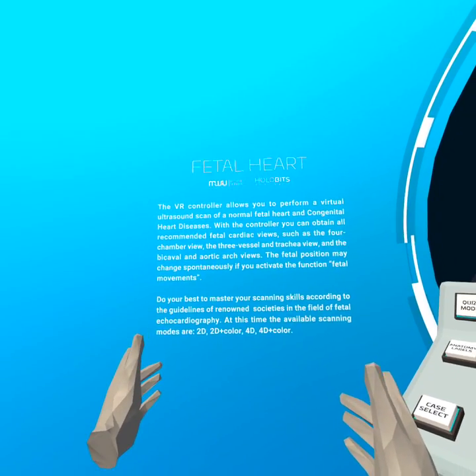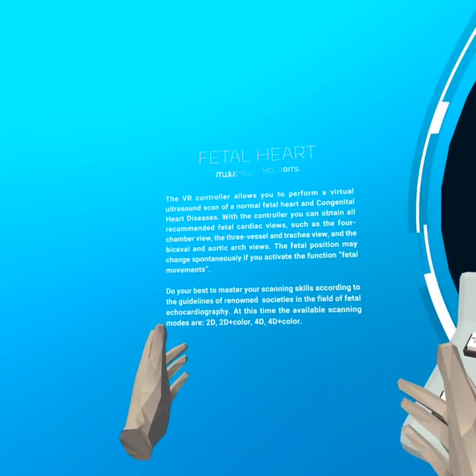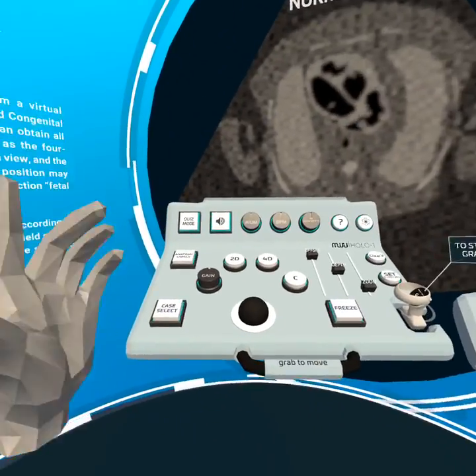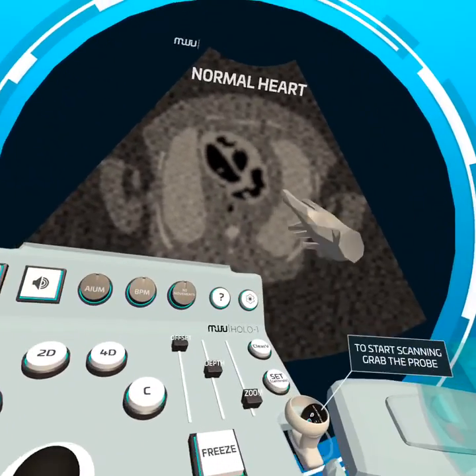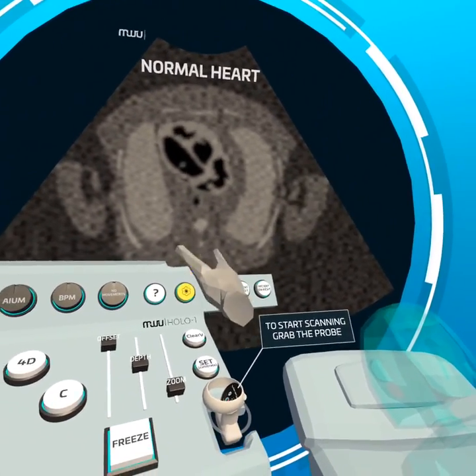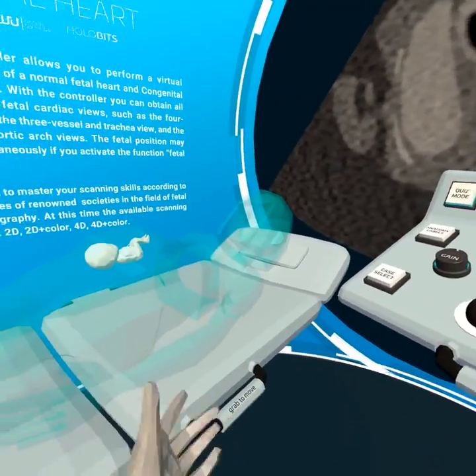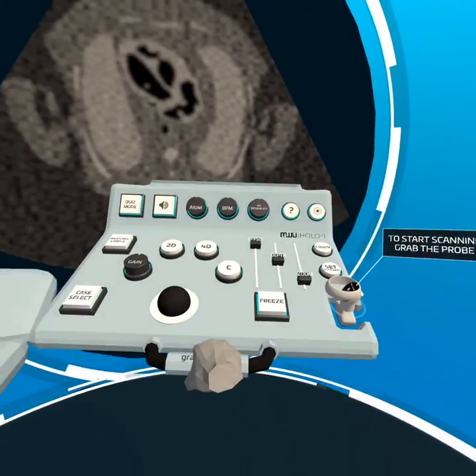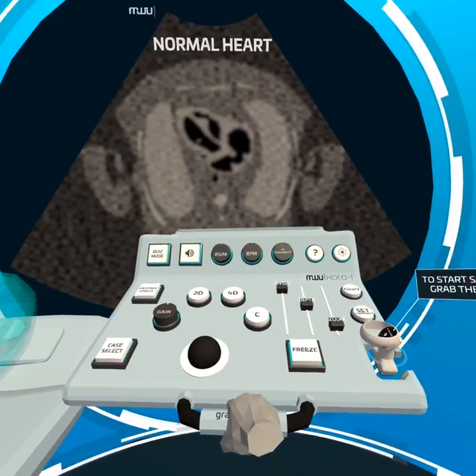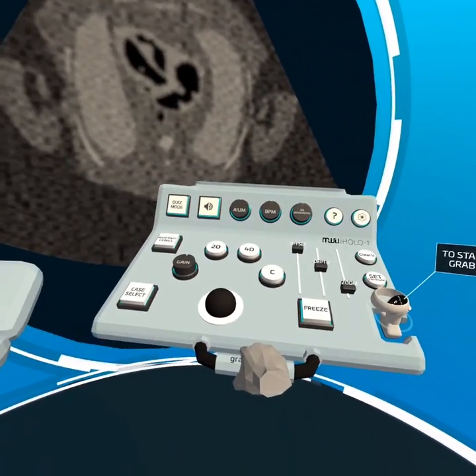Four chamber view, three vessel and trachea view, bicaval and aortic arc views. There's a settings button — I point and it responds. 'Patient on left' — yes please, there we go. I'm doing this sitting down by the way. I can move this around but I notice frame rate drops just by doing that — not very optimized.